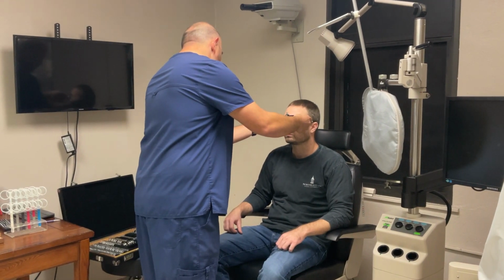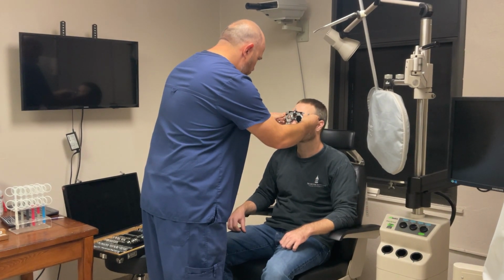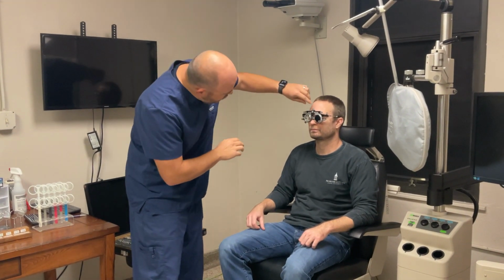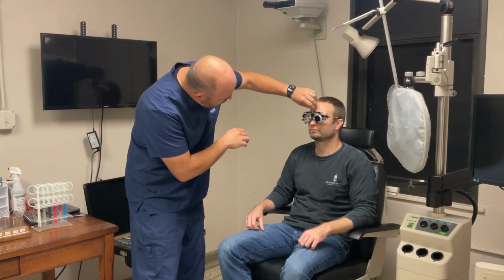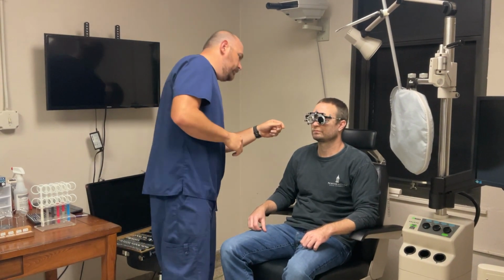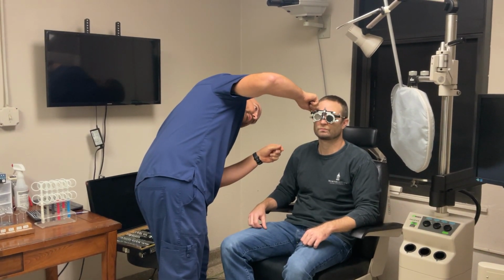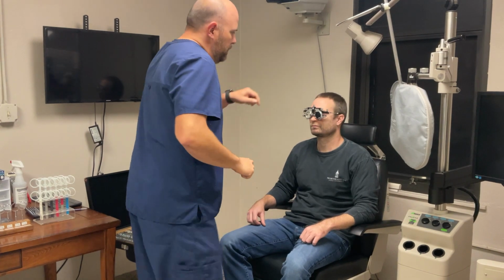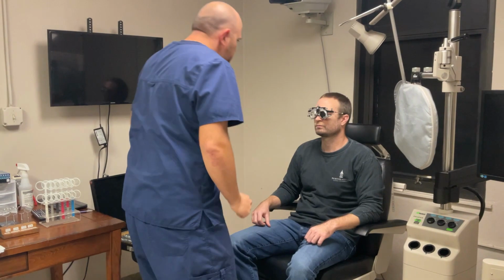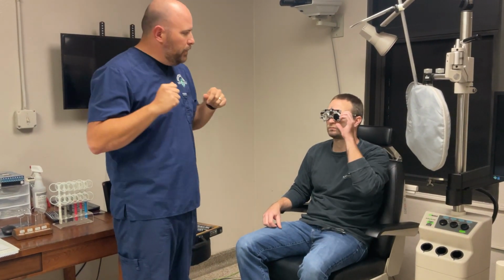All right, Drew, just let me know if that's getting too tight. Is that okay right there? Okay. The next thing that we need to do is adjust the trial frame. In this instance, it's running a little bit low, so I'm going to bring it up just a little bit. Then I'm going to check my pantoscopic tilt and see how we look from the side. We're a little flat, so I'm going to adjust this here and adjust this over here. The pantoscopic tilt, when set correctly, will also better align the frame on the patient's face.